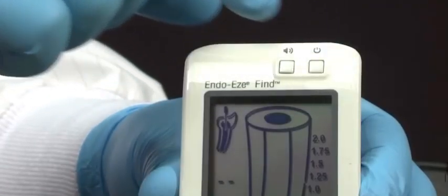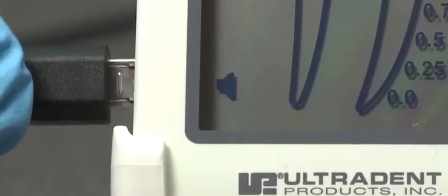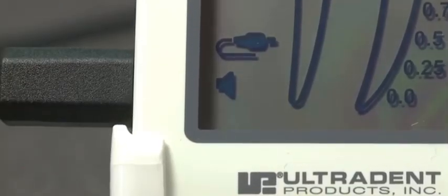Now get ready to perform the electronic measurement by turning the apex locator on. Plug the measurement cable into the left side of the device and make sure that the cable icon appears on the bottom left corner of the display.